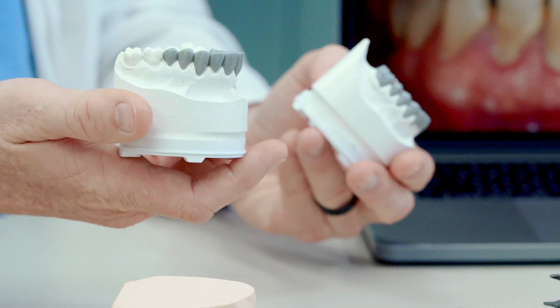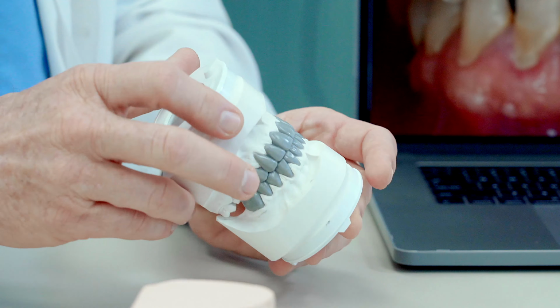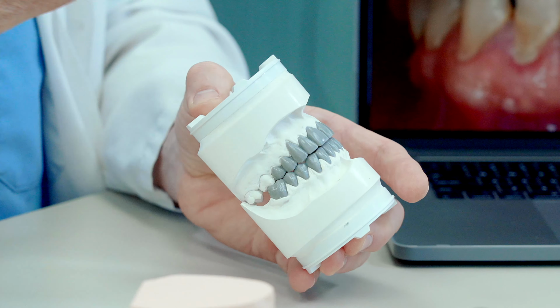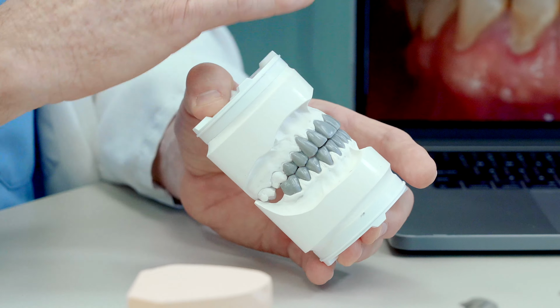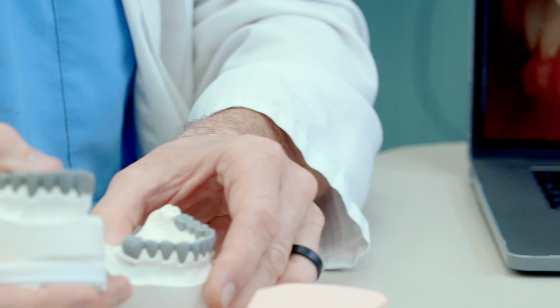And so the first thing that we do is, like we're building a house and we need an architectural drawing or blueprint of the case when it's all finished. And you'll notice here that's what we've done. We've corrected the bite issues, angulation issues, and the discrepancies of broken teeth or missing teeth. We've corrected all that in the wax up.